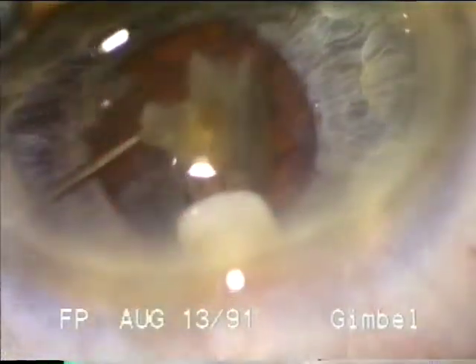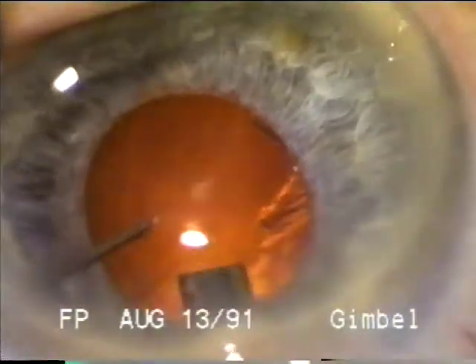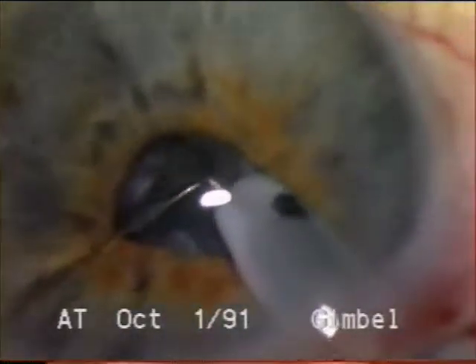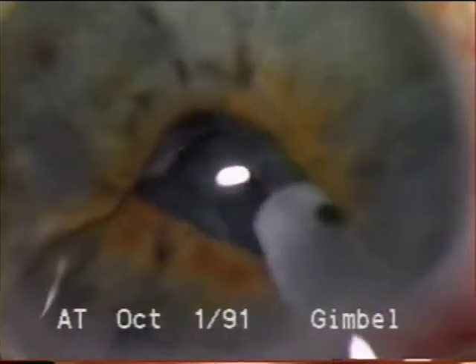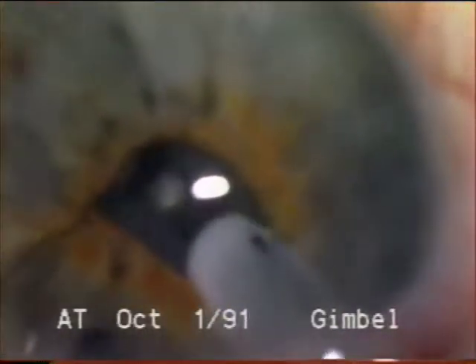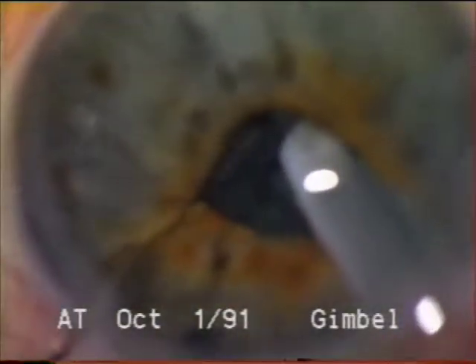Here we see the epinuclear bowl coming freely now to the port. This case — a 2.5 millimeter pupil case — illustrates the extent of the applicability of this technique for phacoemulsification in very small pupils without enlarging the pupil. Nudging the nucleus inferiorly, one can sculpt very deeply in the center without the tip of the phaco going blindly under the iris. The down-slope sculpting allows this deep central sculpting.